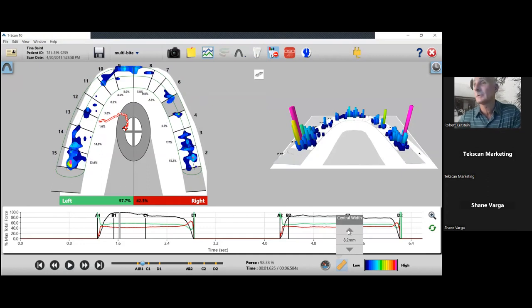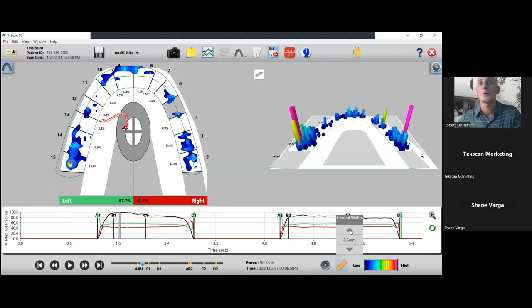These things have to be done even if you measure the central incisor width. You may have measured the right central incisor width and get a data set like this, because the central incisor width is a great feature, but it doesn't correct your arch for you. It doesn't guarantee you a corrected arch. Okay, so here you can see now I have it sized correctly, but there's an edentulous space here.